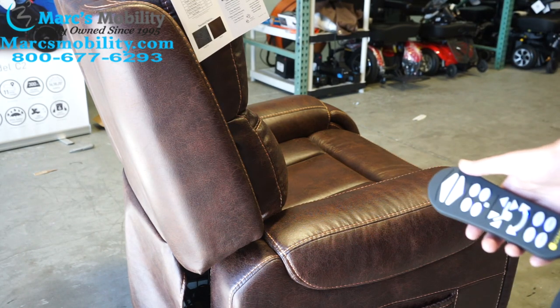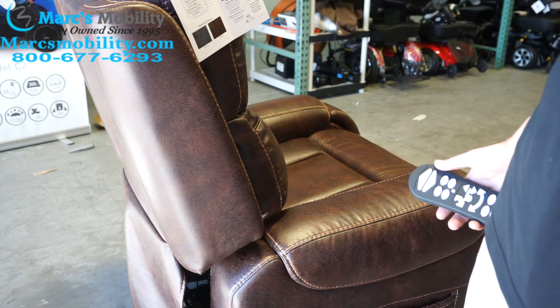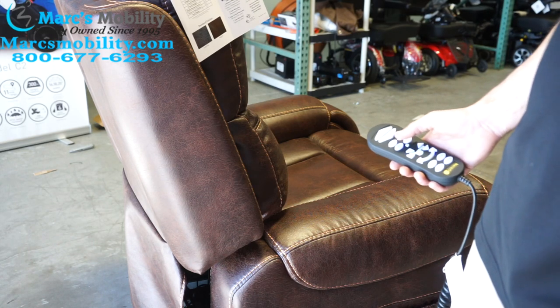Today I'm going to show you how to program the manual functions in a Golden lift chair. I have with me the Twilight Titan, which is part of the DeLuna series.